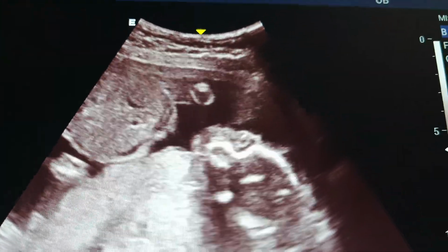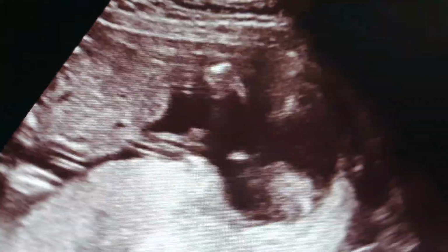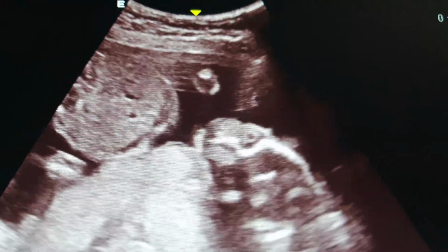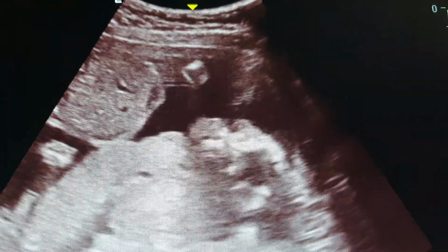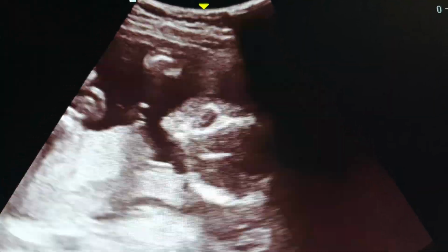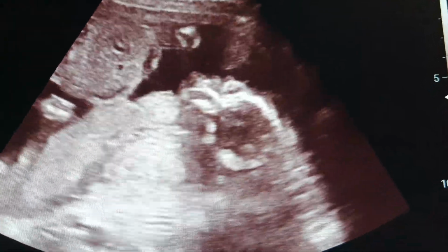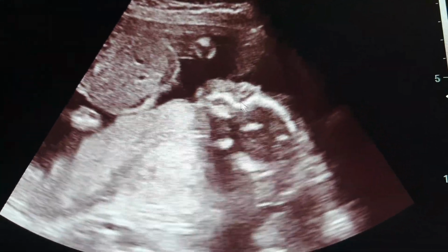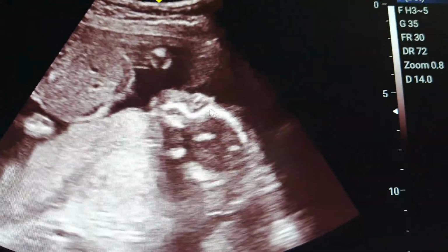Another finding here, which is very important as well, is how the umbilical cord is appearing, because I know that for beginners, the coils of the umbilical cord by 2D ultrasound sometimes are not very clear. So you should know what we can see in an ultrasound like this. I'll try to pause this scene and show you what we can see in this picture if you are still a beginner in ultrasound.